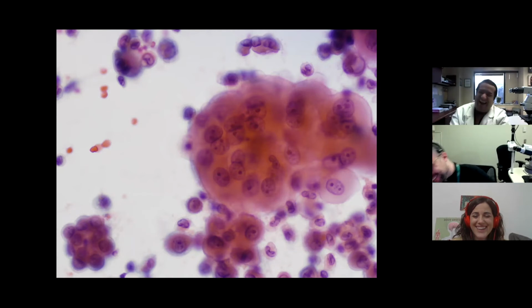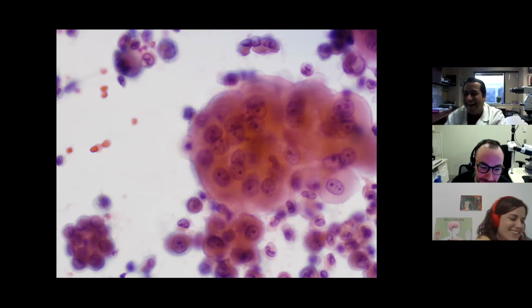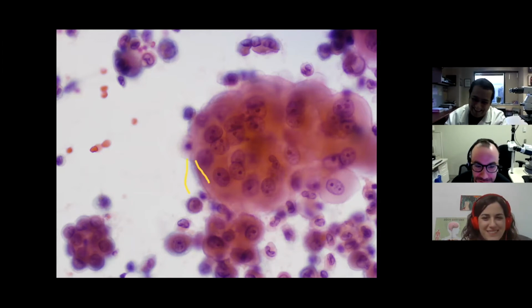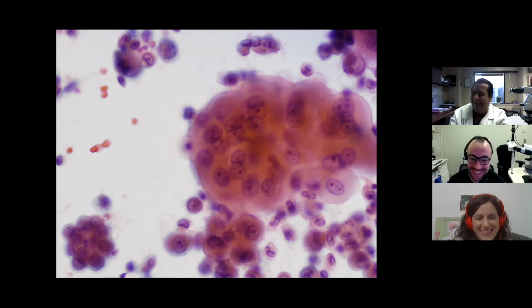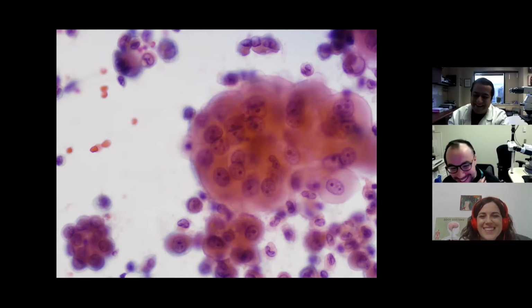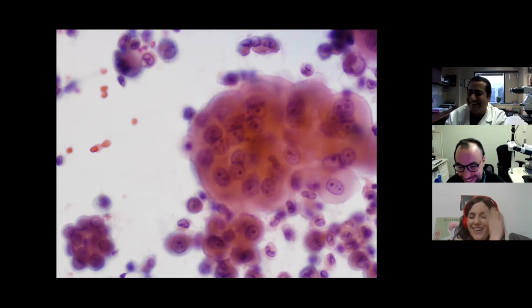There we go. He's showing us the window now. Yeah, I see the window. I see the frilly skirt here of the mesothelial cells. Actually, once you know that BAP1 is lost, the frilly skirt becomes easier to see. This is known as immunohistochemistry-aided morphology.